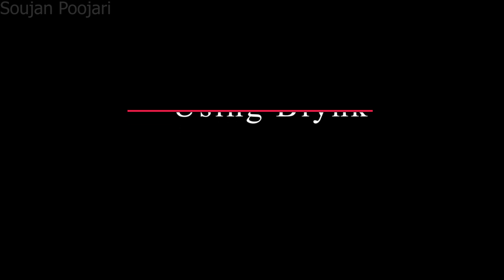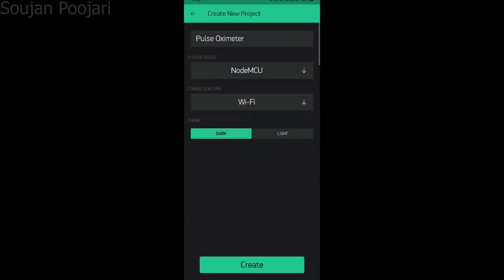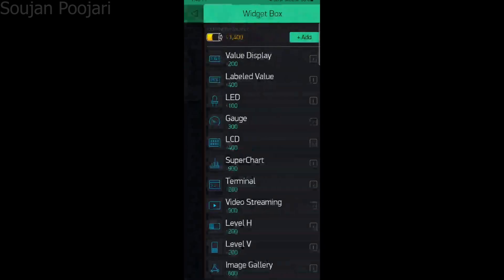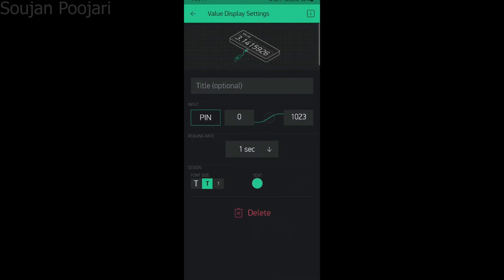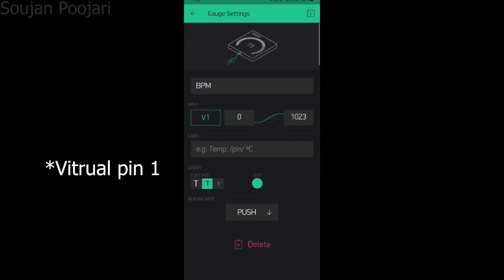Step 3: using the Blynk application. We have finally arrived at the last part of this video. Click on new project, give the project name, and select ESP8266. First, add two gauges and two value displays — one will show you the BPM and another will show you the oxygen. Select virtual pin V7, set the value from 0 to 130, and you can also change the color.